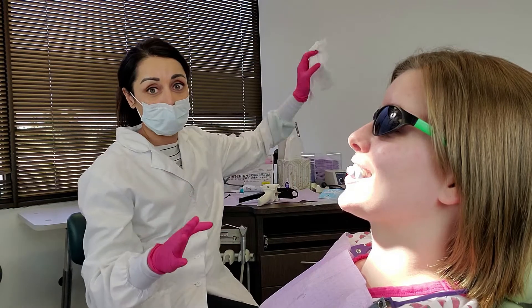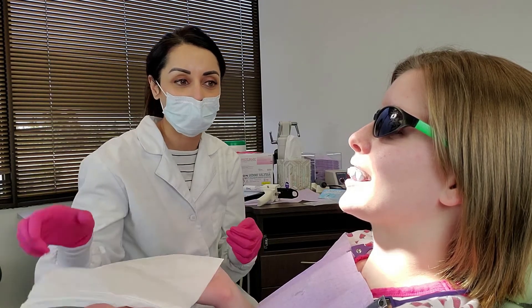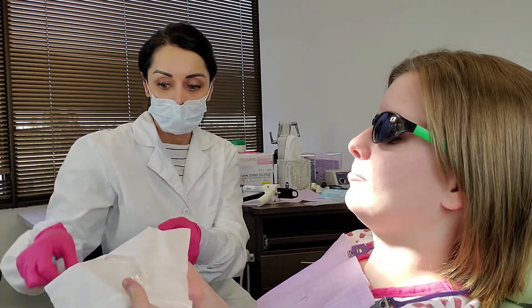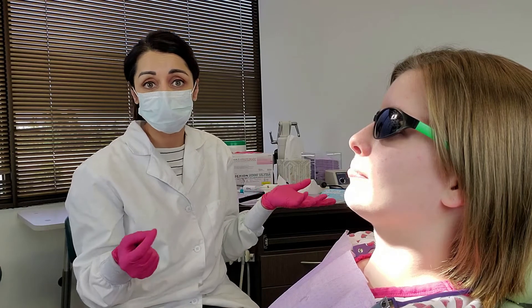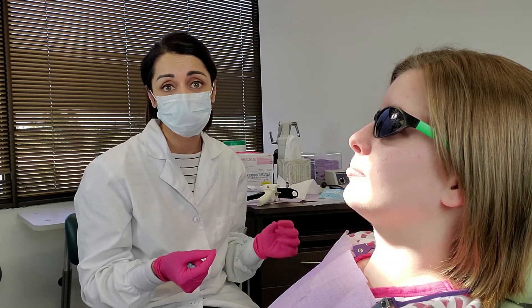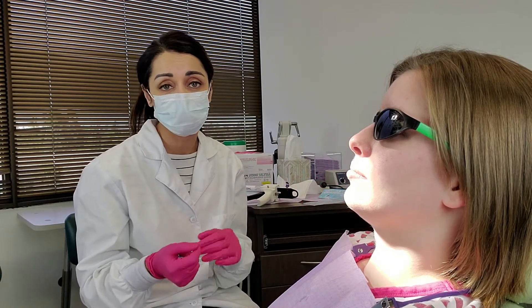It's been 40 seconds, so we'll take everything out — the Aqualizer and the front part of the bite registration. I usually give patients a Kleenex to wipe their hands on. If these patients are experiencing a lot of pain and have to wait for the guards to come back from the lab, I'll send this Aqualizer home with them so they have something to wear until that custom guard comes in. Most of these patients are heavy clenchers and grinders, so I'll warn them: they may pop the Aqualizer, and those little pads of sterile water will burst. If they end up with some water in their mouth, don't be surprised — it just means the pads burst, and they should throw the Aqualizer away because it's no longer useful.